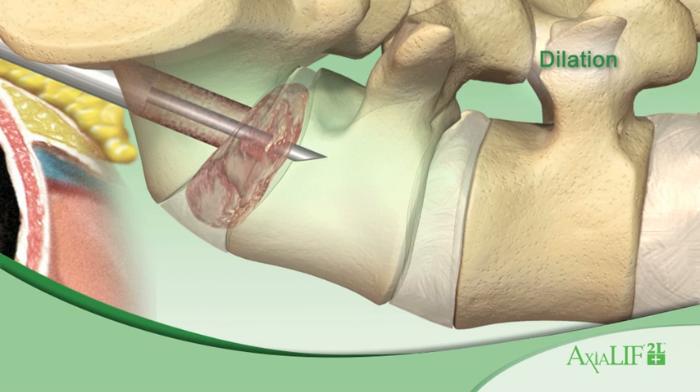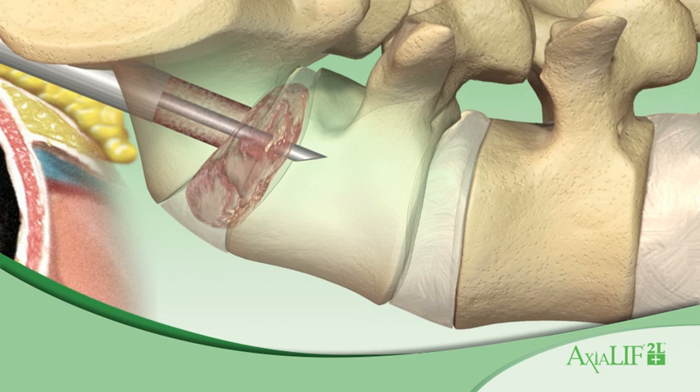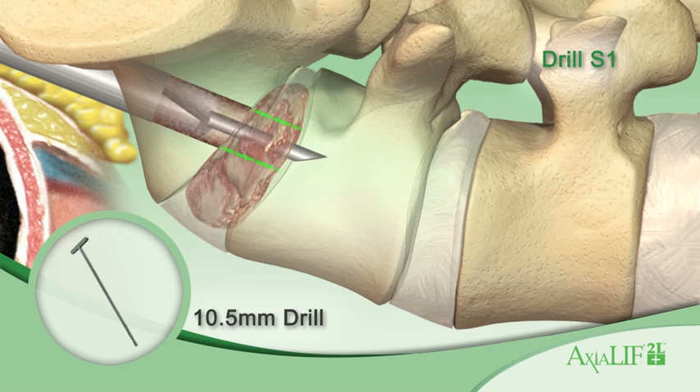Remove the 10 mm sheath with the 8 mm dilator. Insert the 12 mm dilator and sheath into the working channel. Remove the 12 mm dilator and leave the 12 mm sheath in place. Drill into the L5-S1 disc space with the 10.5 mm drill.